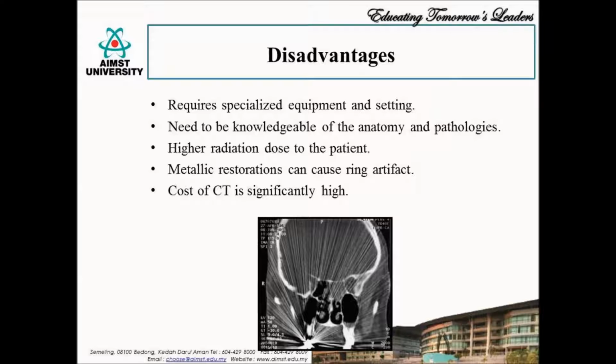To summarize, CT scanning offers many advantages for proper diagnosis during implant treatment planning, including accurate cross-sectional imaging and three-dimensional visualization of all the anatomic structures. But the high dose to the patient and certain artifacts caused by metallic restorations, if present, are of concern and should be considered.